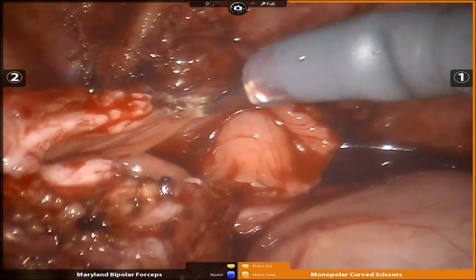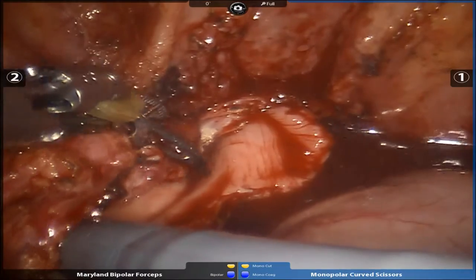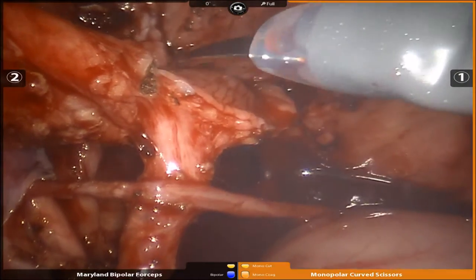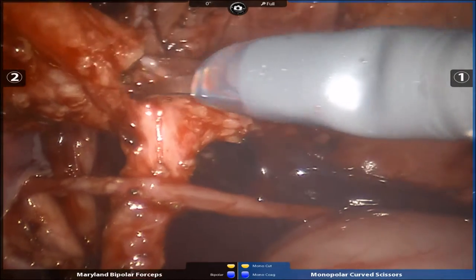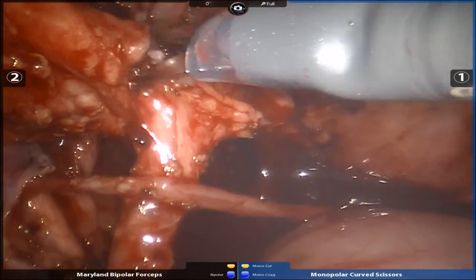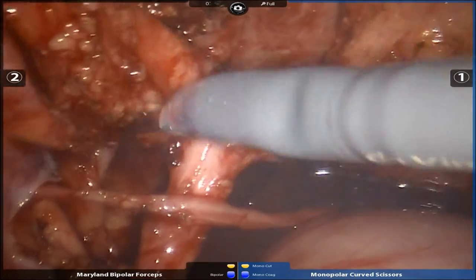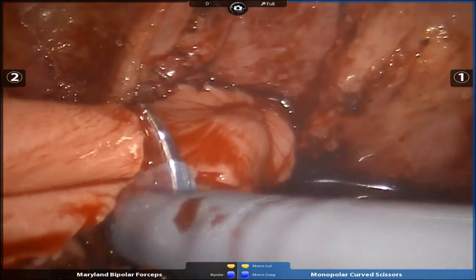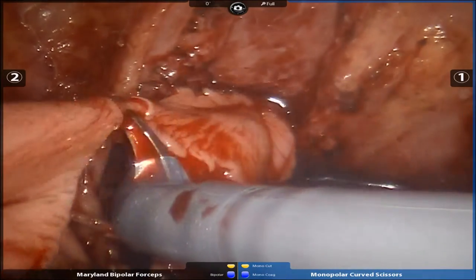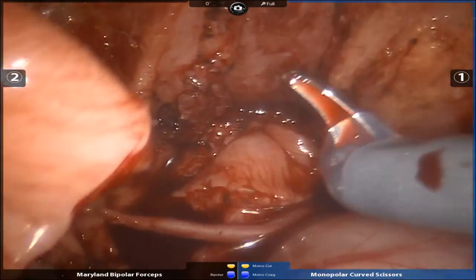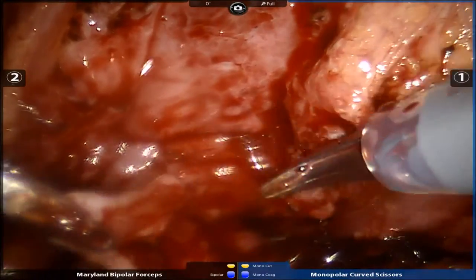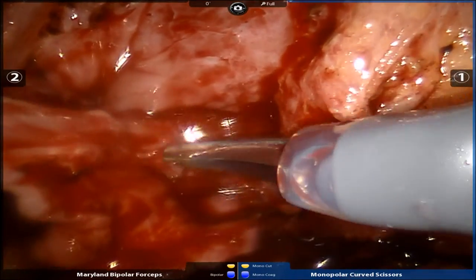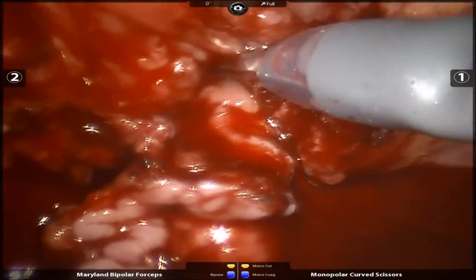The diverticulum is entered for easy identification of the diverticular os and medial dissection of the diverticulum from the lateral surface of the ureter. The remaining medial edge of the diverticulum is carefully dissected from the lateral edge of the ureter.